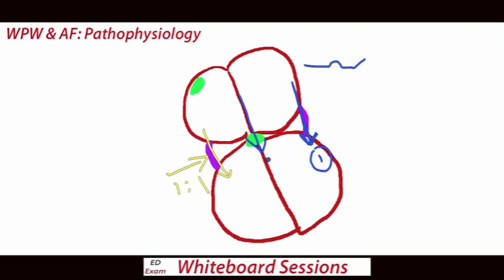and shortly thereafter the impulse that's passed via the AV node will arrive. So depolarization will start from this impulse and then be quickly caught up by the second impulse. So you'll see the delta wave from the first impulse, then the normal QRS will take off after that. So the delta wave is from this bit of conduction.